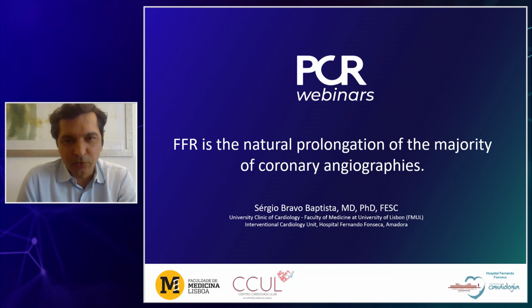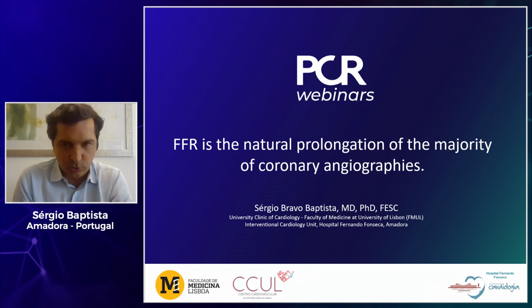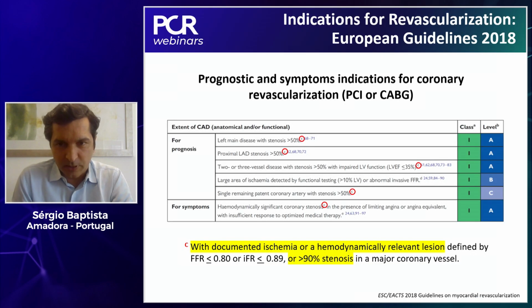It is my role now to convince you of FFR as being the natural prolongation of the majority of coronary angiographies. And you were talking about guidelines. Well, the European guidelines clearly state that you should not revascularize lesions if they are not ischemic lesions, and that can be shown either by a non-invasive test or by an invasive test, either FFR or iFR in our guidelines.